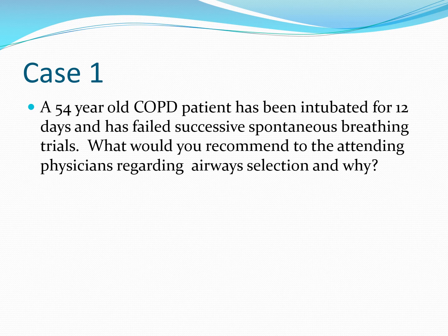Now we'll quickly look at some cases, and then we'll come down the home stretch here. In this case, we have a 54-year-old COPD patient who has been intubated for 12 days and has failed successive spontaneous breathing trials. So really the theme of this one, what would you recommend? What we're going to recommend is that the patient be tracheostomized.